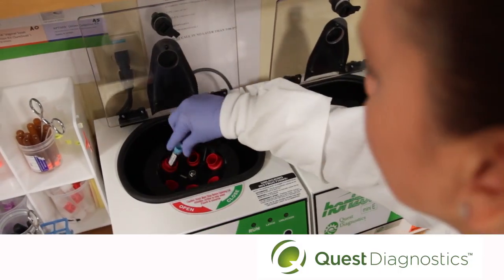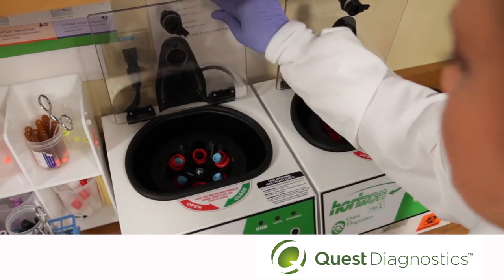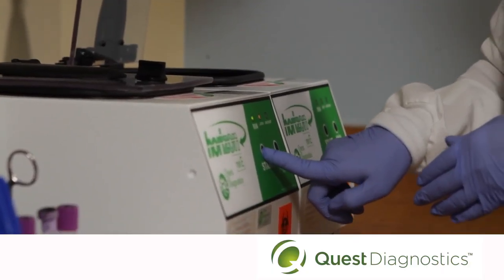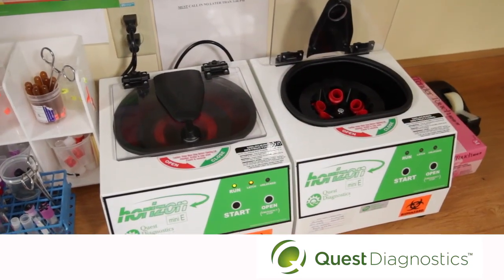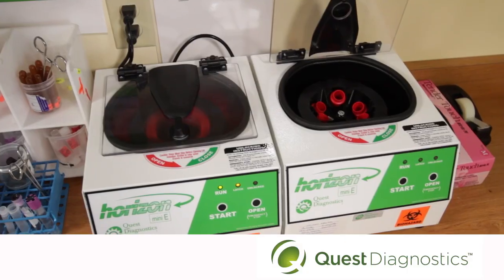After drawing and inverting the specimen the required number of times, your next step is to spin the tubes in the centrifuge. When loading the centrifuge, take care that the tubes are evenly balanced, spun at the proper speed, and for the proper length of time. Centrifuge for 15 minutes at 1500 g within one hour of collecting the specimen.